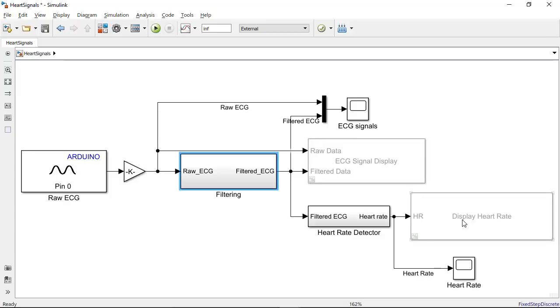Next step for me would be to test this algorithm as the code is running on the hardware. For this, we have external mode in Simulink. It is a simulation mode that allows you to monitor data on the scope block as the code is running on the hardware.